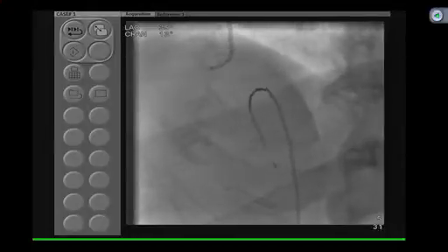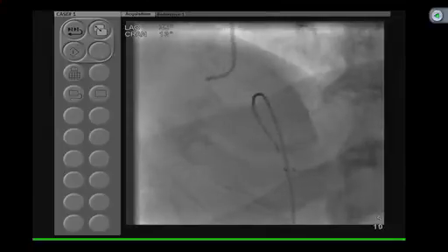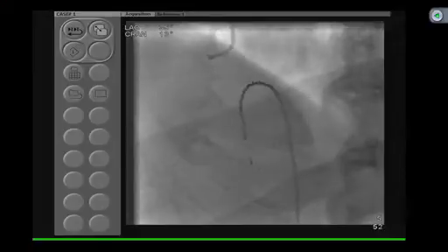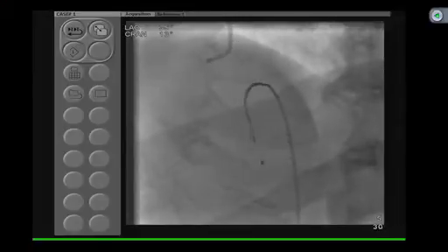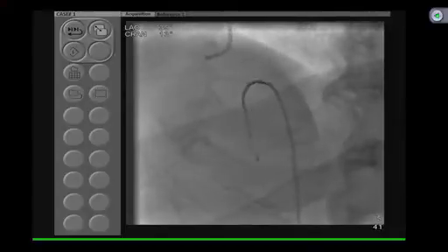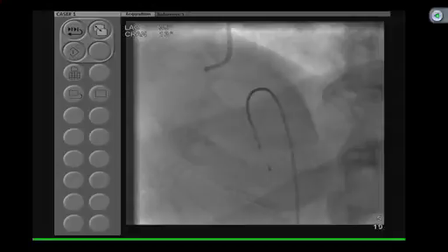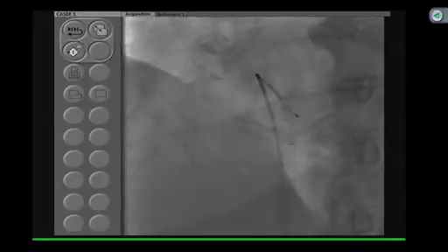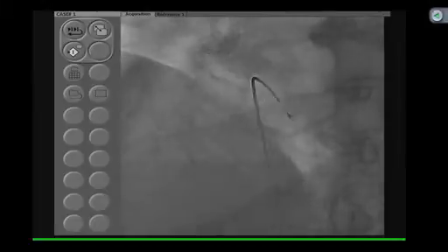I can tell you as the biggest proponent of rotational atherectomy, if somebody wants to just do a high pressure balloon dilatation and or maybe AngioSculpt or cutting balloon and then put a stent is completely fine. Therefore, we just try to see how maybe we can take some poll and people can give the opinion what they will do in this particular situation. Just because of the calcium, we felt that we will go ahead and use the rotational atherectomy.